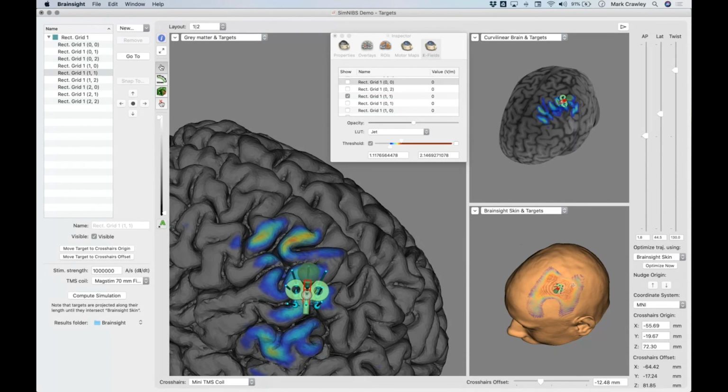we'd imagine. Yeah, I think that the coil definition files, I think they make measurements from a range of places on the face of the coil. And that's what determines the field distribution on the scalp. But I don't know if you can move the center of that point to one of the windings, whereas in this, it's always in the middle of the coil itself in the hotspot. There's maybe some behind the scenes trickery can be done. Yeah, I reckon you could probably figure something out.